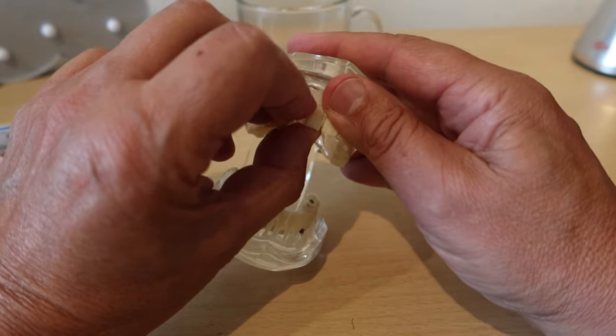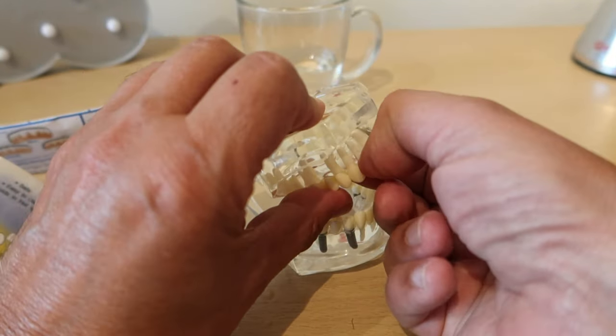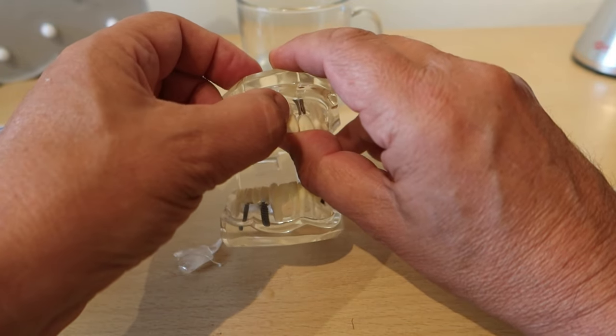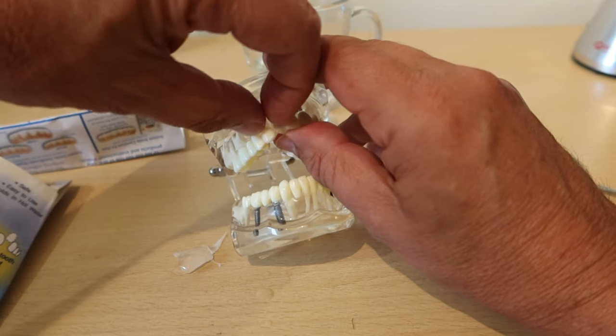When you've roughly got it in place, use your nail to scrape away any of the excess from the front which is going to show. Don't throw that away because it will harden and you can reuse it again later on.